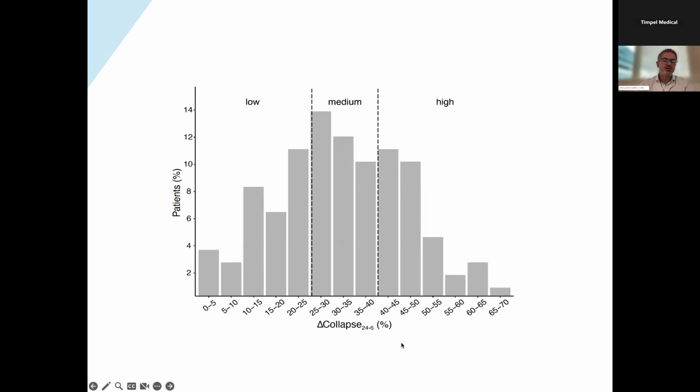And these were COVID patients, right? I've heard many people saying that COVID patients are less recruitable than other patients, but you'll see that it's clearly not the case.